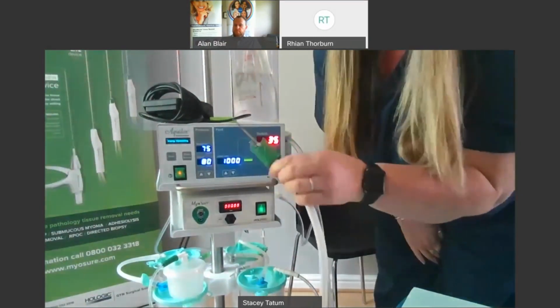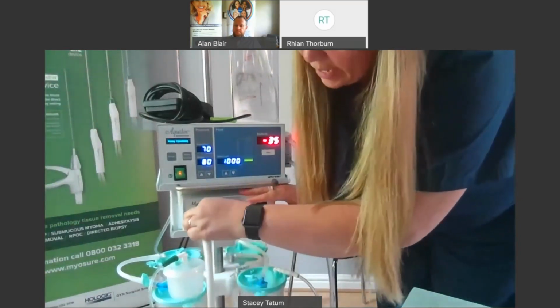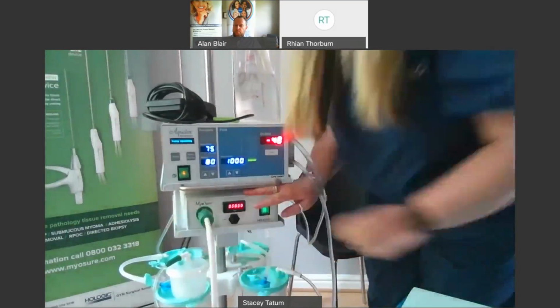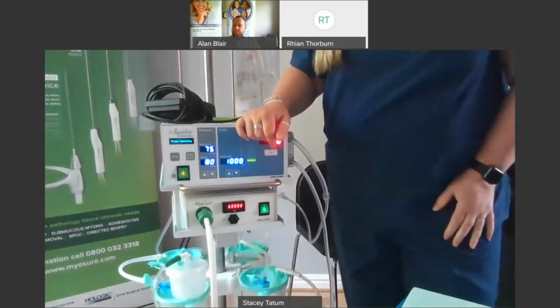And then the MyoSure cutting device goes into the MyoSure controller. It has an arrow to point you in the right direction, and that will just click into place. And then it's ready to do the procedure.